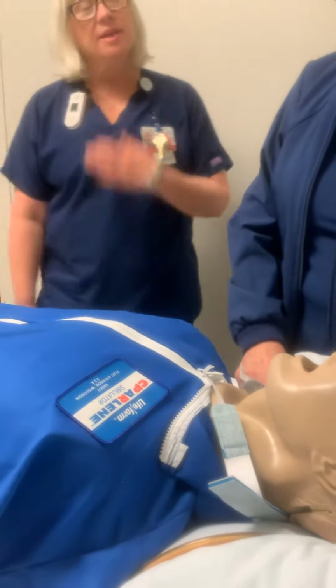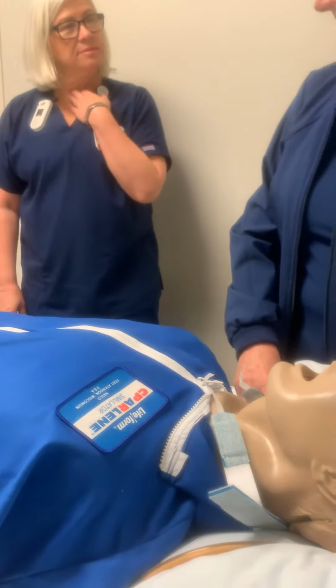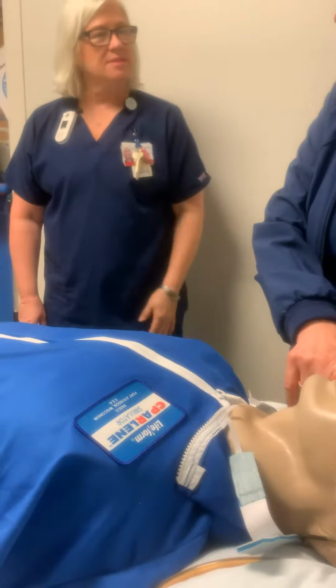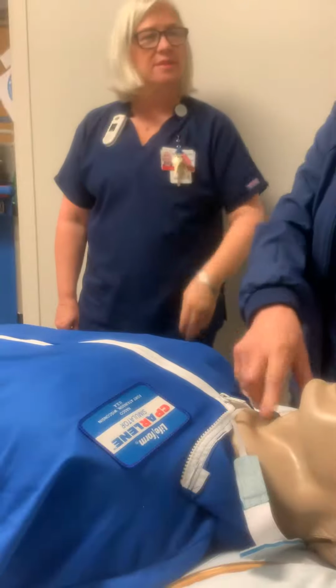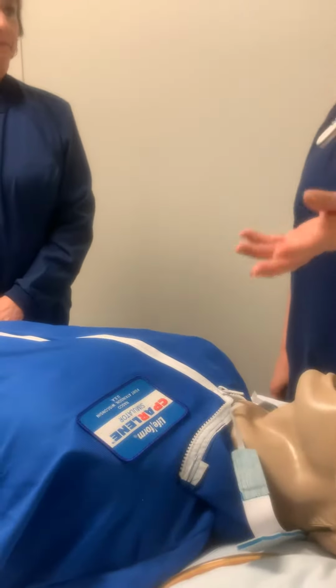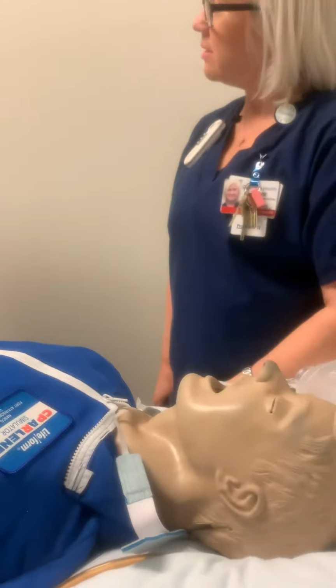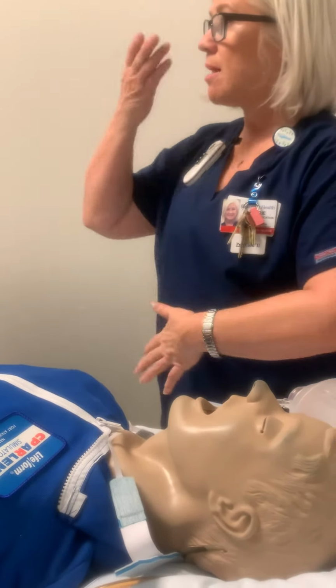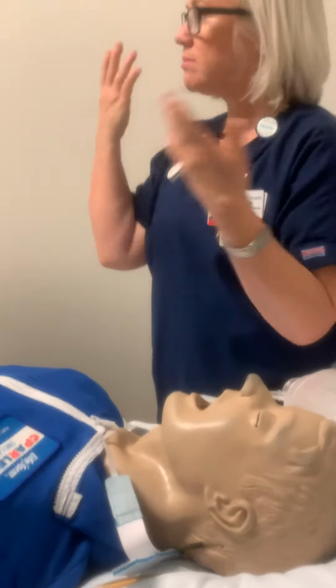Is it an option to ventilate them here? It doesn't matter either way. You can, but I usually go low, you can straight push to the top. Okay, you can cover that. But if they're all swollen back here, because sometimes after radiation and things like that they may be swollen, you can always go to the stoma. That's the beauty about a trach. You can do upper or stoma.